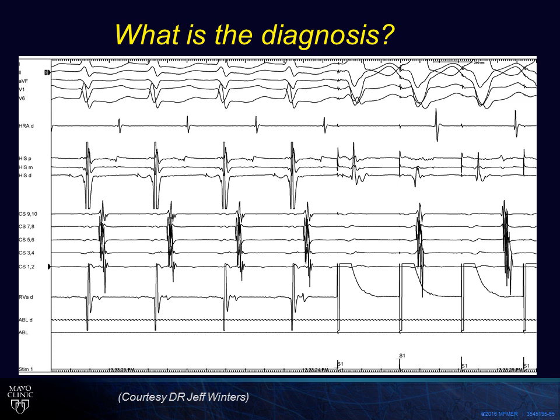So here is an interesting case. Ventricular overdrive pacing was started. You can see that this is a fusion, whereas this is much more fully paced, and the tachycardia was ongoing. It fell just before the His, less than 40 milliseconds before the His is acceptable, because it takes 40 milliseconds to ascend up to the atrium. And you see, this does not conduct to the A and terminates the tachycardia.